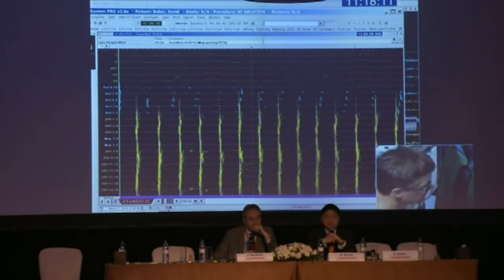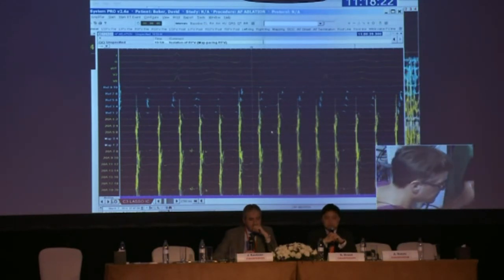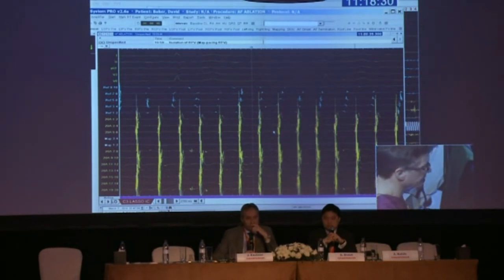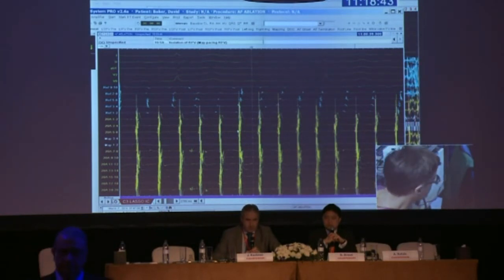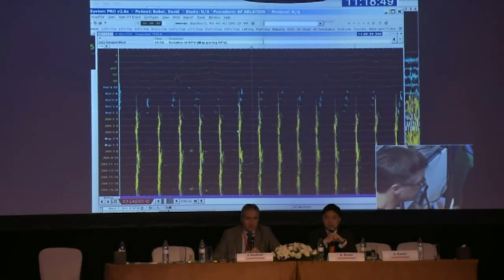So with that starting point, and because I could see patterns, I could then begin to try and find an area or go back earlier than PV 5-6 until I couldn't get any earlier. If it's complete random chaos, you can't do that. If you can't see a pattern, you can't see a generalizable appearance, you can't do that kind of mapping. And then you've just got to start to try and organize it either by giving a drug or by picking off the most chaotic and fast areas in the atria with CFE ablation. So it's not necessarily the speed, it's being able to see a repetitive pattern within that chaos that is the key.